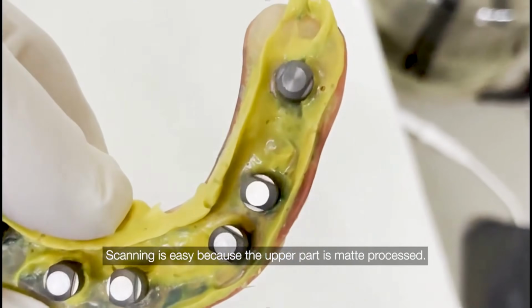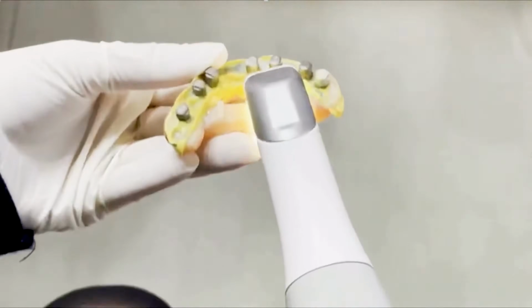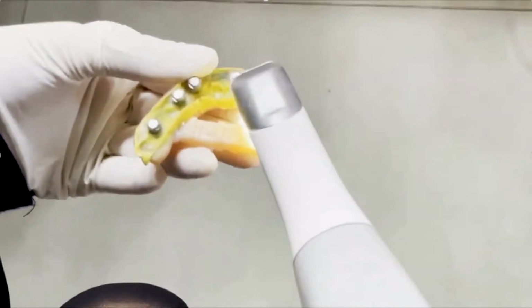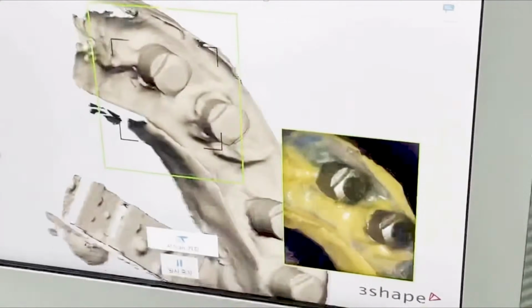First we take the bite scan to record the occlusion, and we scan the cylinder scan bodies. These cylinders allow the scanner to capture the exact implant positions. The software reads the geometry and converts it to digital coordinates.